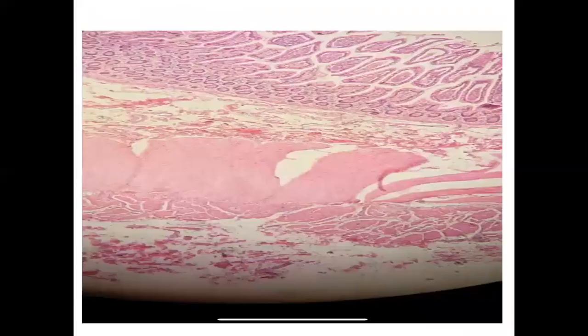That's the details. هاي من هاي حتى نبين السيروزا بشكل أوضح. هذه الطبقة الخارجية هي السيروزا.